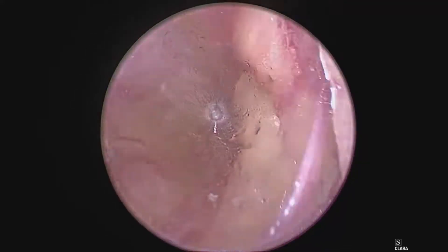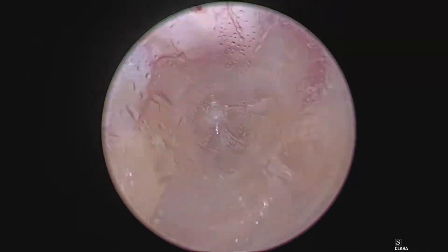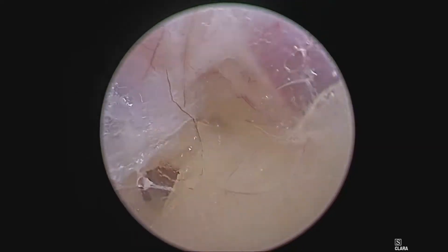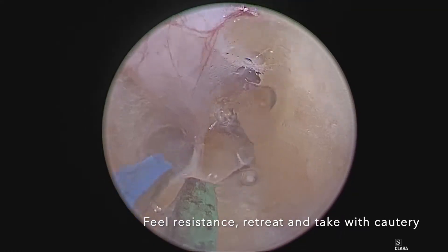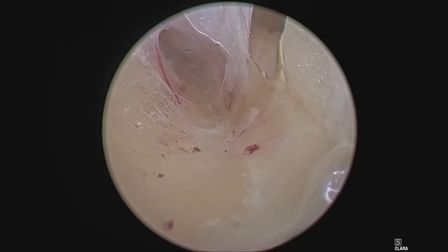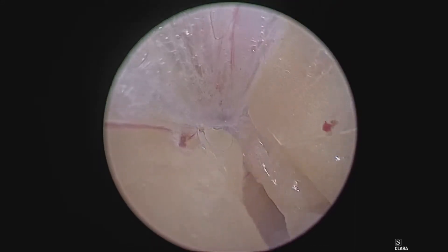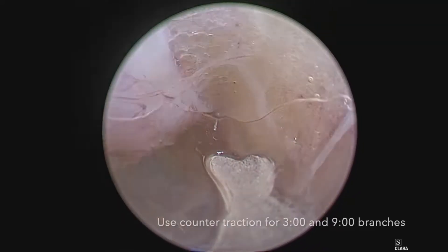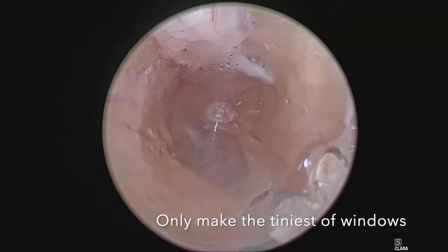Continue your dissection posteriorly, staying right on the vein at 6 o'clock. There's no need to do any more dissection than what I'm doing. Here I have a little vasovasorum, so I take it with the blade rather than just push through and potentially create some bleeding. I've cauterized that area so that when I dissect it won't bleed. Here's another small branch. I use counter traction with my inside hand and make the tiniest window again with just the tip of the conical tip.